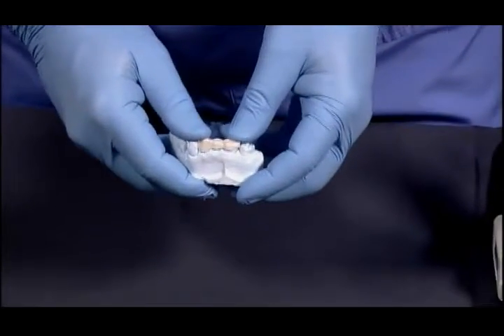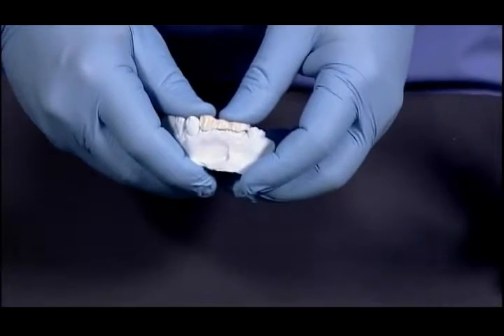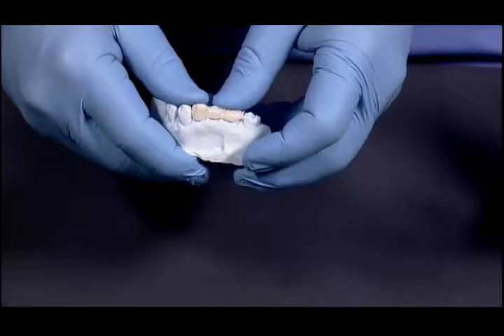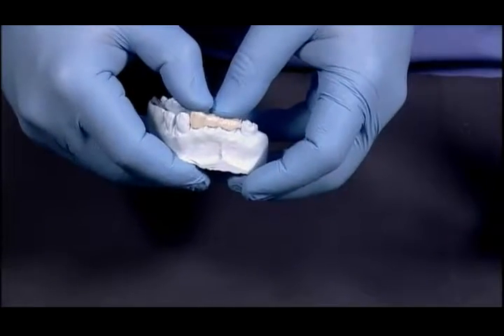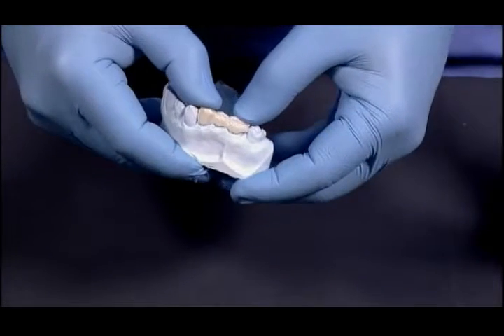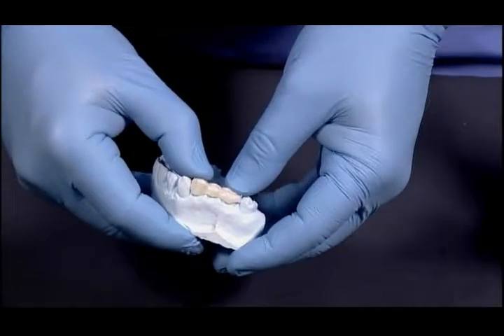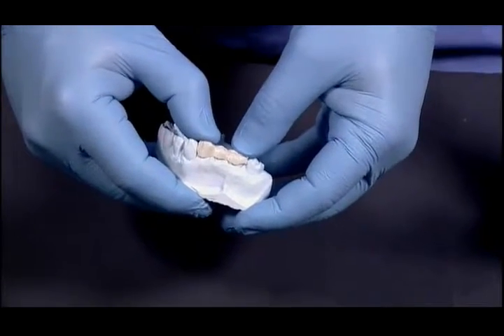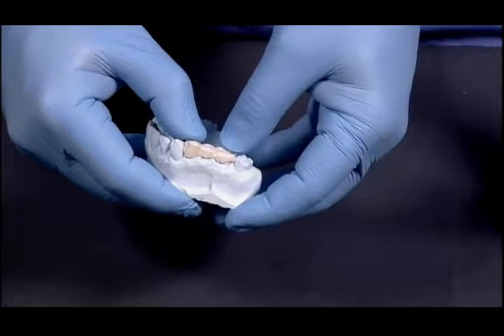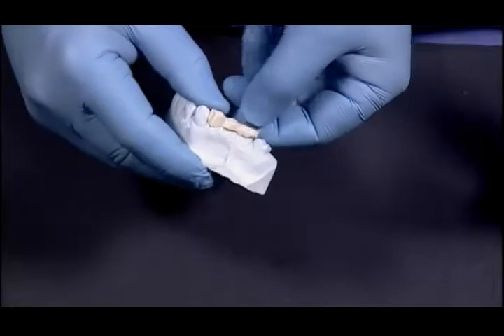All right, we return back to the patient with our trimmed polycarbonate direct crown shell. And you can see we're short of the margins a little bit. We're not really worried about that at this point in time. We just want to make sure that we have a passive fit. In reality, in the patient's mouth, we'd have them close down, to make sure that we can get as close to being fully seated as possible with this restoration.